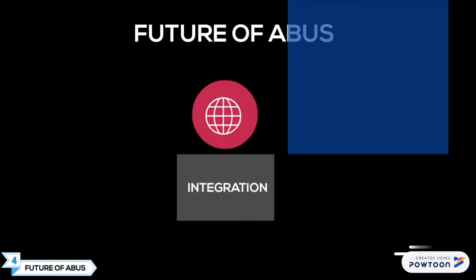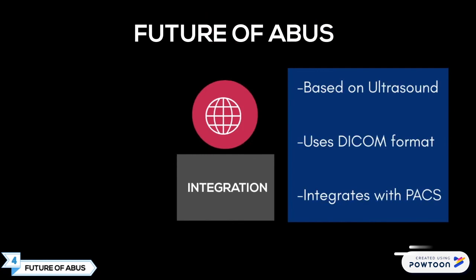In order for ABUS to be a successful technology, it will need to fit into our current system. ABUS is based on ultrasound, which is already heavily integrated into the current healthcare system. As a result, ABUS uses the same DICOM format that is used in PACS systems throughout Canada. This allows for efficient integration without significant complications.